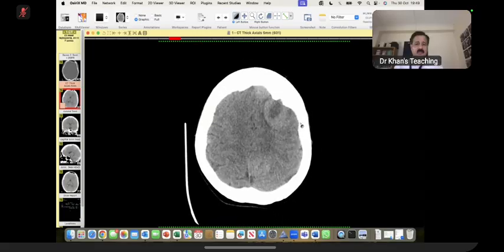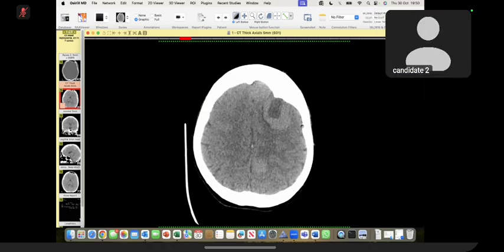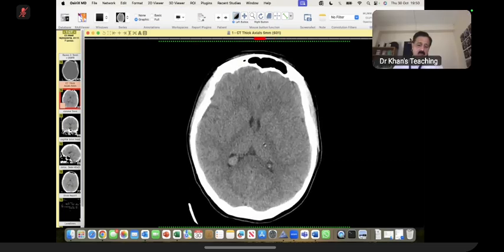I was asking you, where is it location wise? So in bilateral, in left high frontal regions. I don't think so. You understood my question.